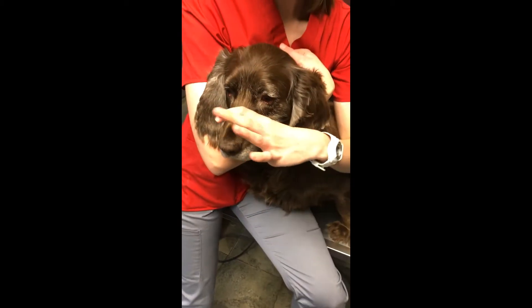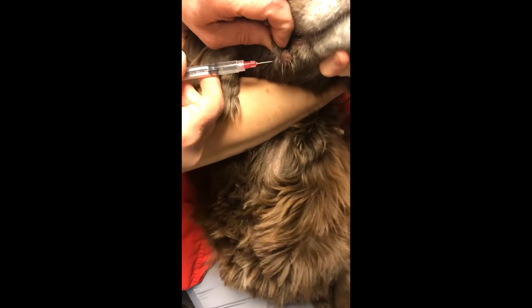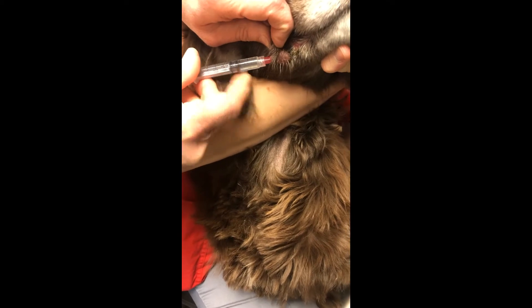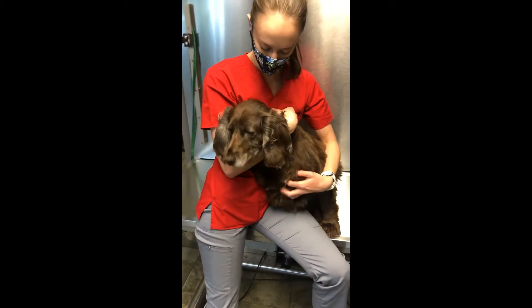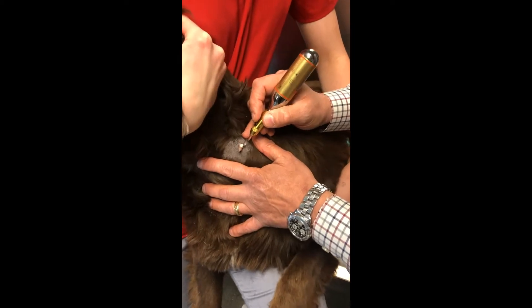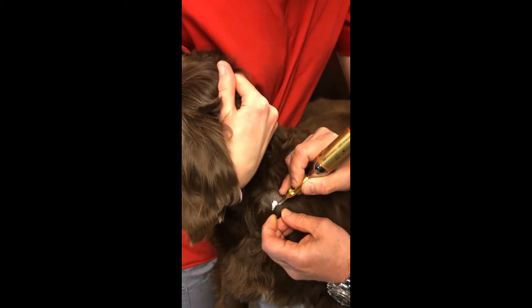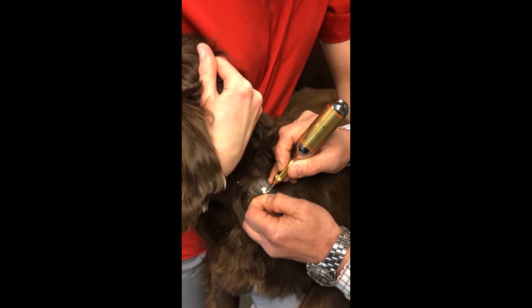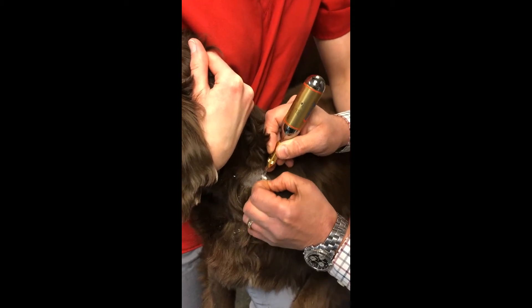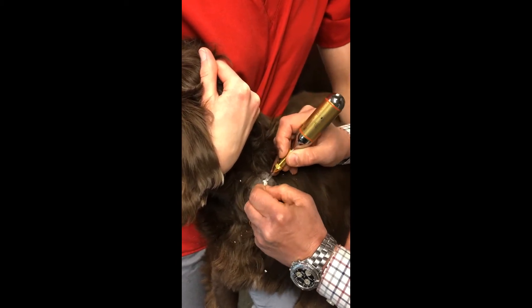In her particular case it's going to make life a little bit easier. We're going to need to shave this area, so after I put the lidocaine in we'll give it a little shave and let the lidocaine work. We're going to go ahead and freeze this mass from the base to the apex over a period of about 45 seconds, removing any ice that is forming so we get the application of cold directly on the tissue.